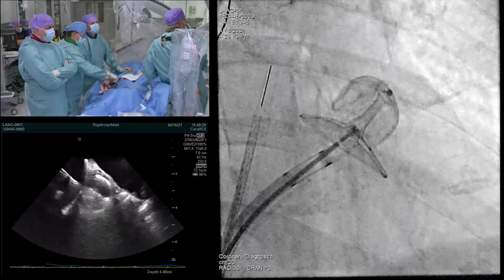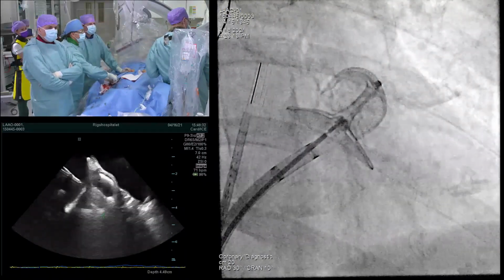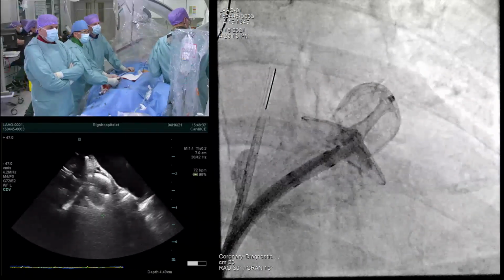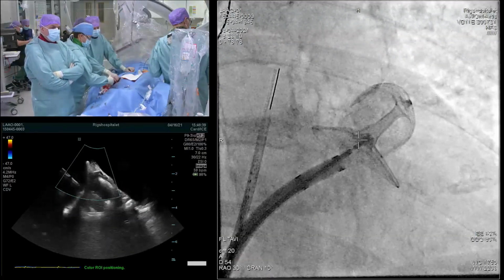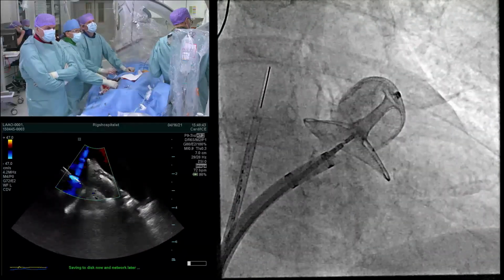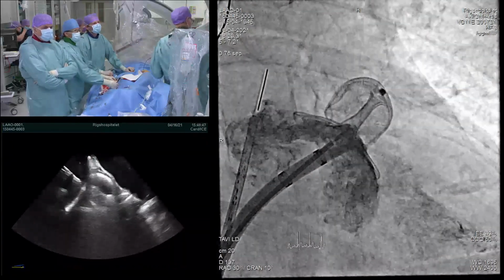At least for the Amulet device, it's been shown that if the disc is covering the Coumadin ridge, the ridge between the left atrial appendage and the left pulmonary veins, the risk of having device-related thrombosis is much smaller. So that's what we should aim for in these patients. And you did an injection here, Ole. Just what are you seeing here?